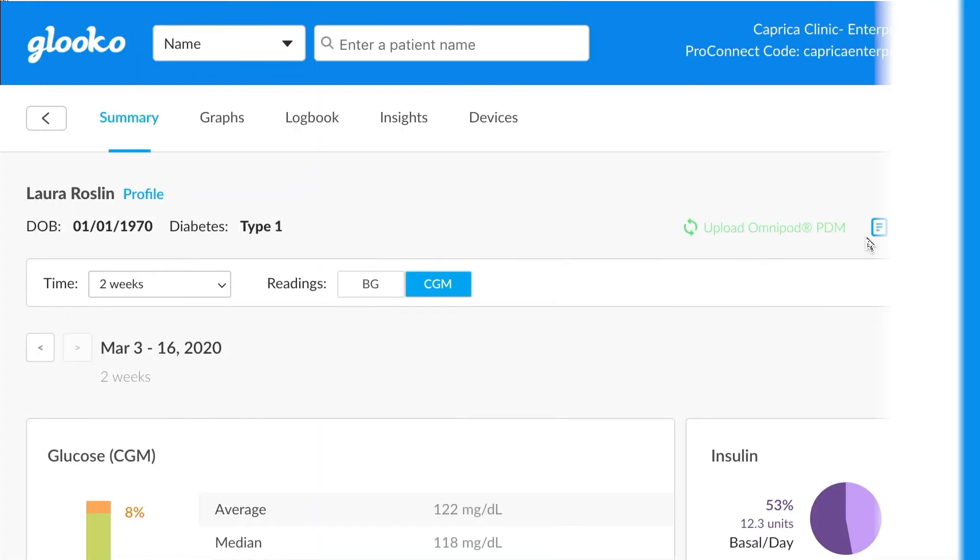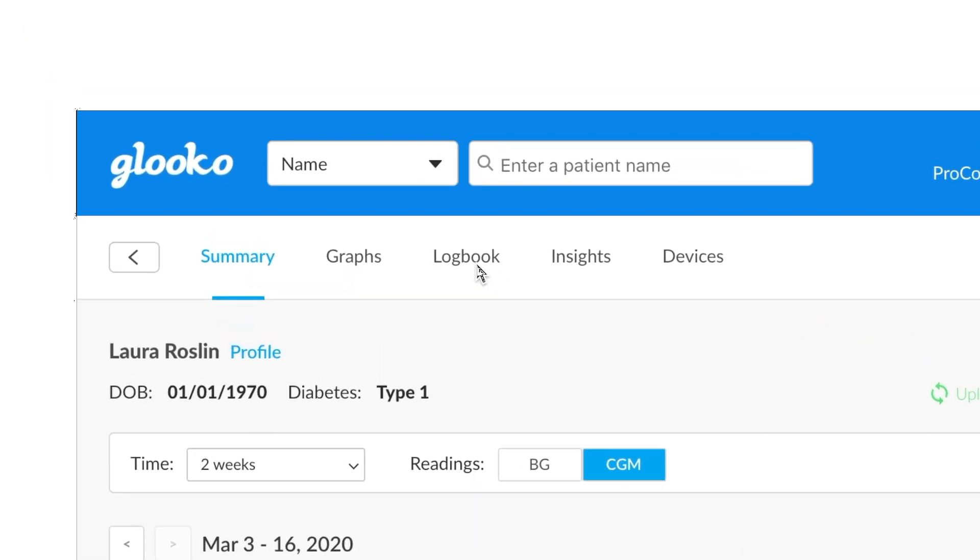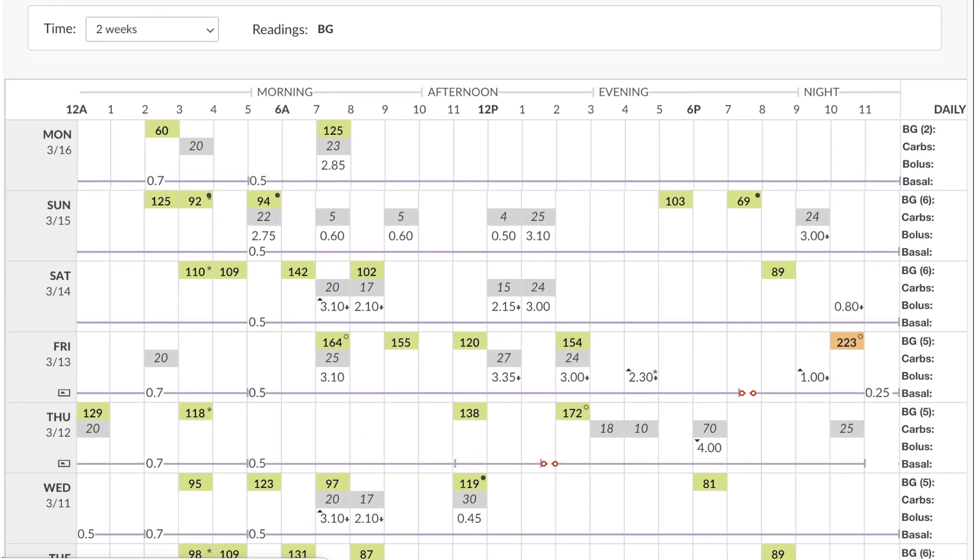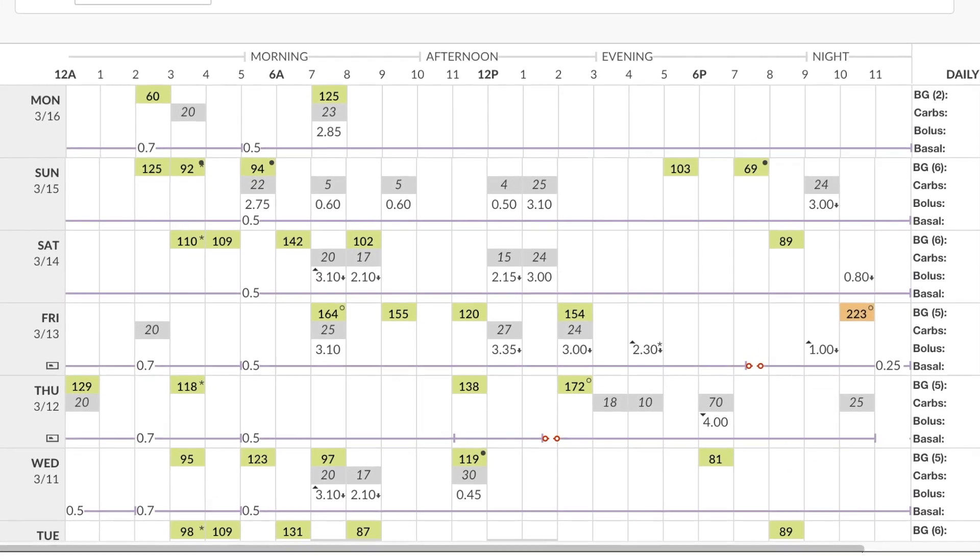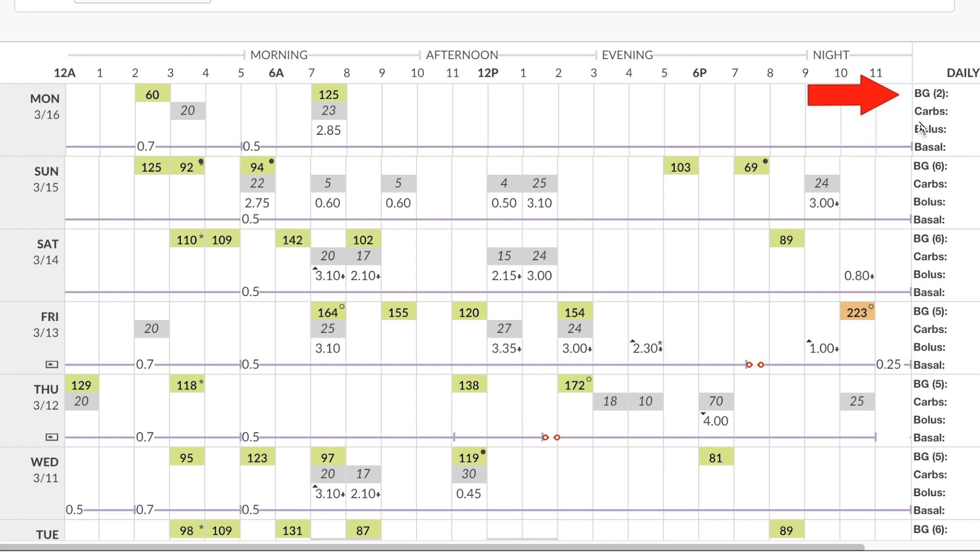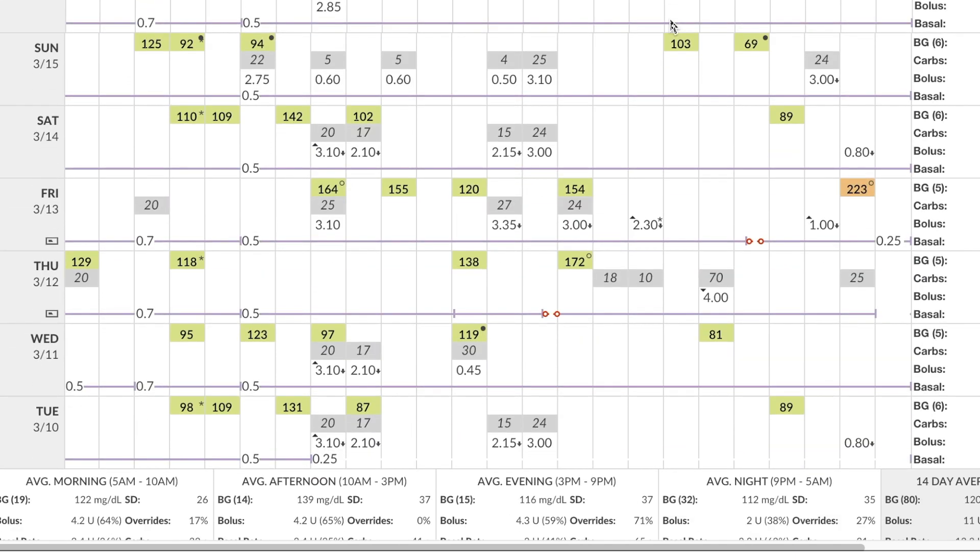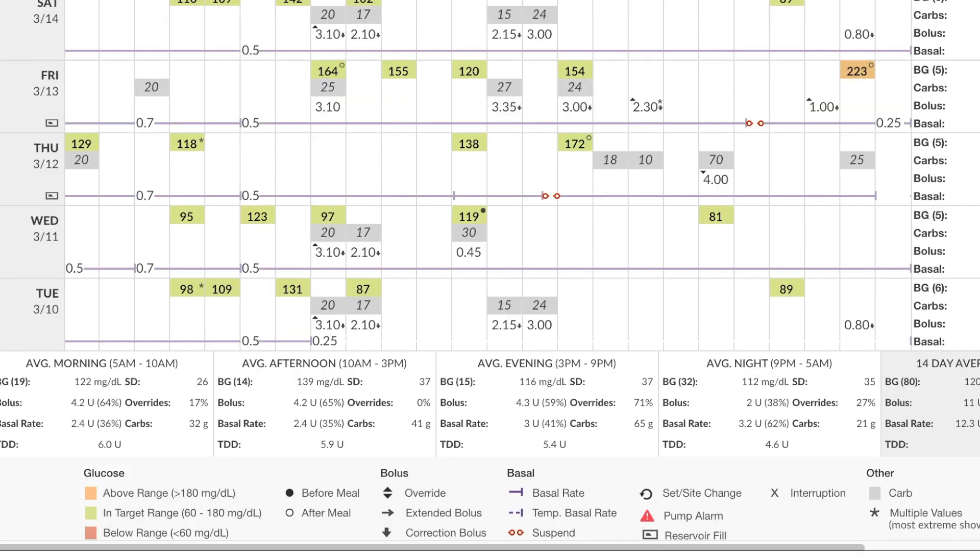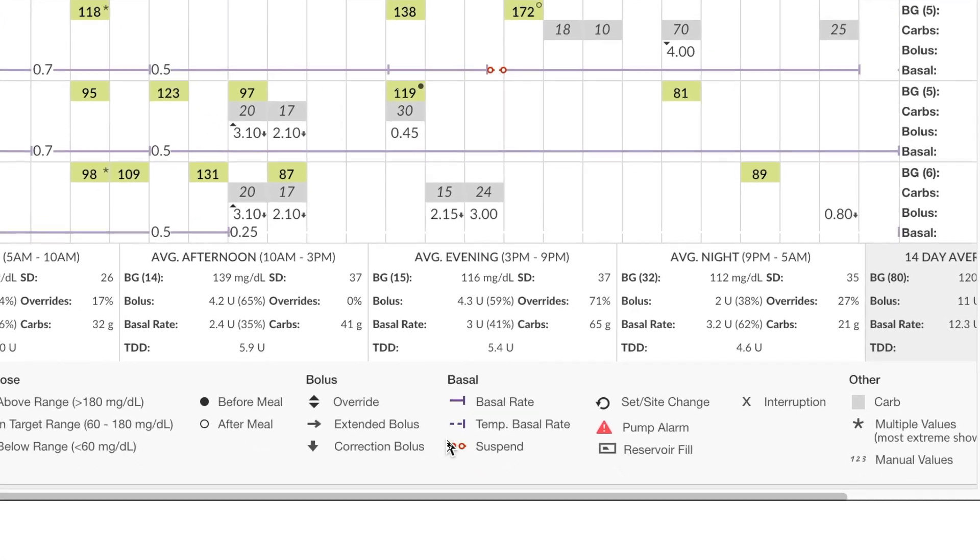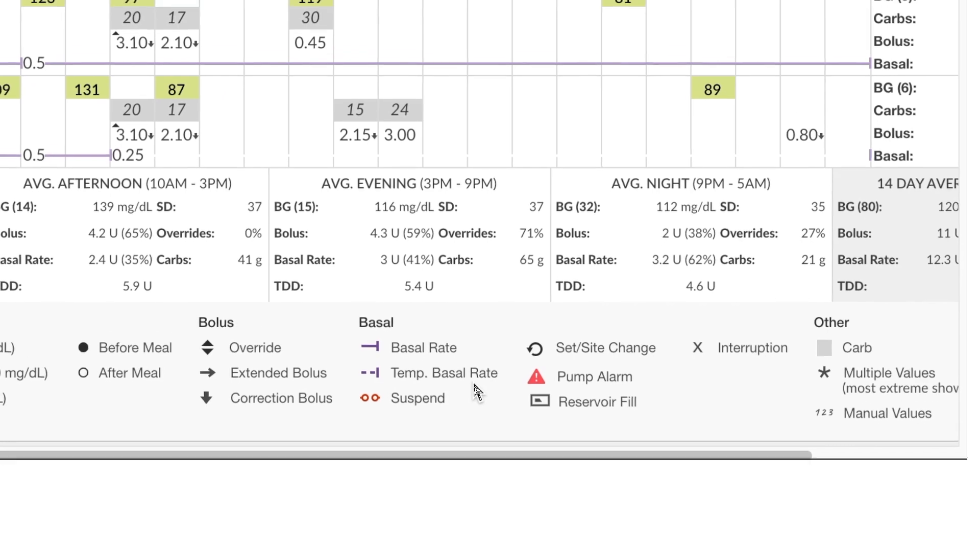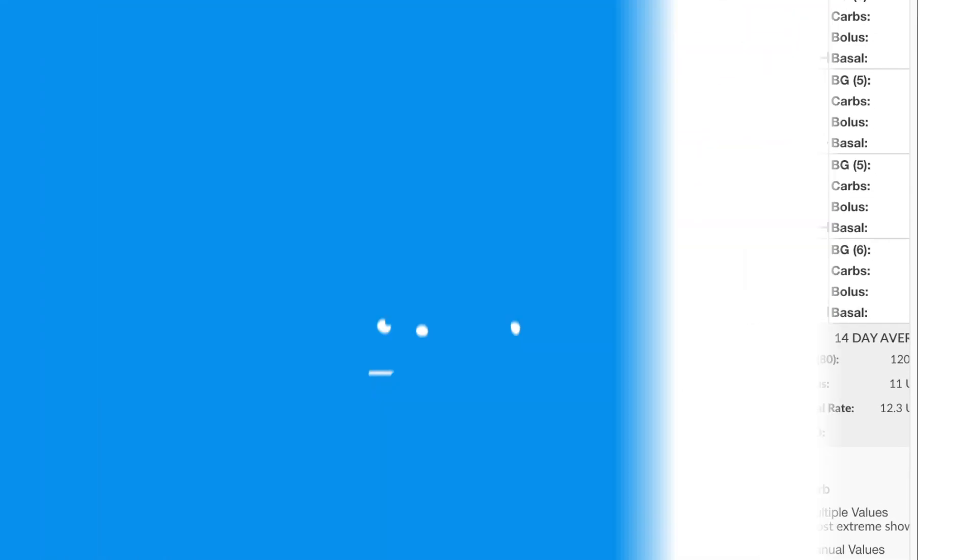One of the other very important sections would be the logbook. From the logbook, which is generally the place where you can see PDM data most clearly, you will see that it is kind of in a graphical view and gives you day by day of basal, bolus, carbs, and blood glucose values. If you have any questions about the icons within the graph, I highly recommend you scroll down to the legend at the bottom. It's going to tell you what the icon for temp basal rate is, for instance, or when there was a suspend on an account.